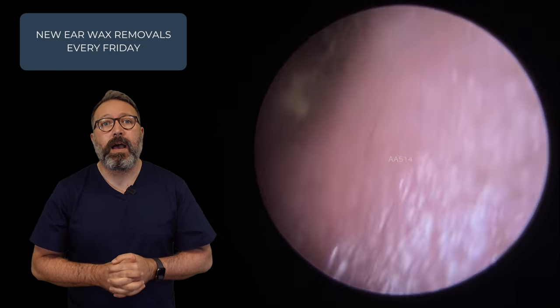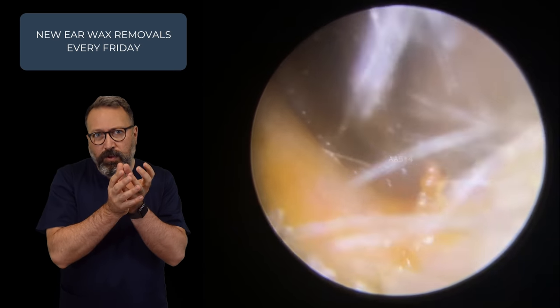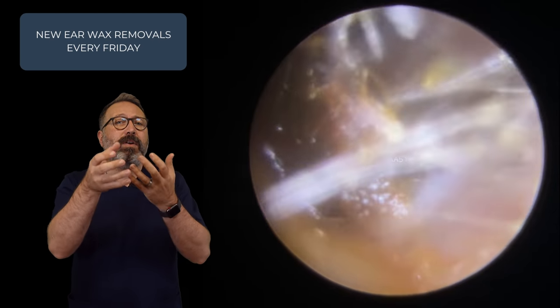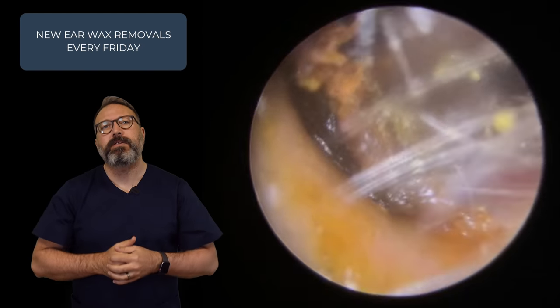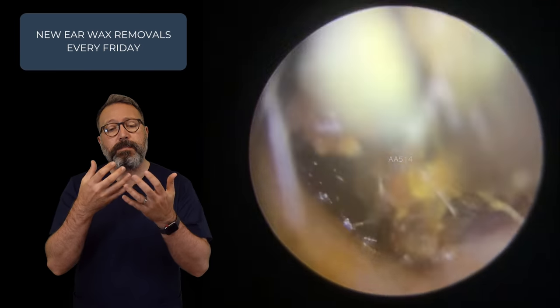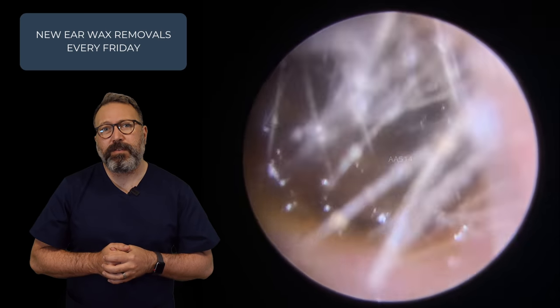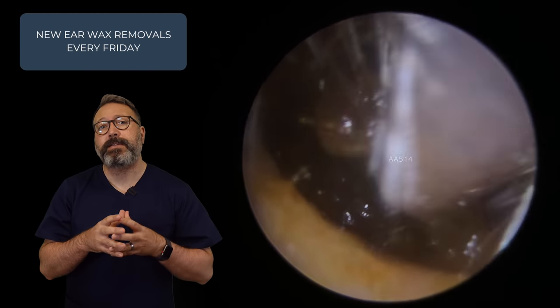So this is the patient's other ear now, and you can see it's very, very blocked up — ultra dense cilia. It does make it a little bit more difficult when these little hairs on the outer part of the ear canal are really closely clustered together and really dense, because when you're using an endoscope you have to sit behind the tools, and when the ear canal is very, very full the wax tends to come right to the outside edge. So we're just trying to wiggle this out. Those hairs actually have quite an important job — they sit on the outside of the ear canal and stop any bigger bits of dirt and debris from getting inside. I'm really having to wrestle with this one — it is super duper sticky. I've popped a little bit of olive oil in to help everything slide across the skin that little bit better and to help me get a better grip.